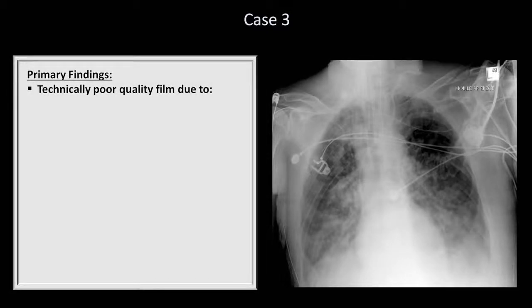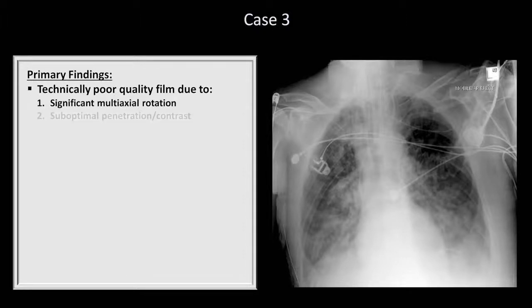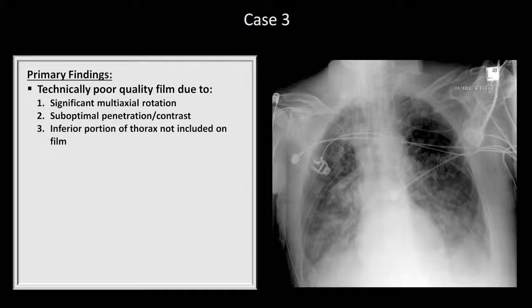He's rotated with his right side lower than his left, which is generally a non-issue. However, if you look at how the spinous processes in the cervical spine relate to the clavicular heads, you can see the spinous processes are much closer to the left clavicle, meaning the left shoulder is rotated forward relative to the right. This can impact assessment of the cardiac and mediastinal silhouette. In addition, the vertebral bodies are not visible behind the heart, which suggests suboptimal penetration or level of contrast. The final observation regarding technical quality is that the inferior portion of the thorax is cut off the bottom of the film altogether, limiting evaluation of the diaphragm.